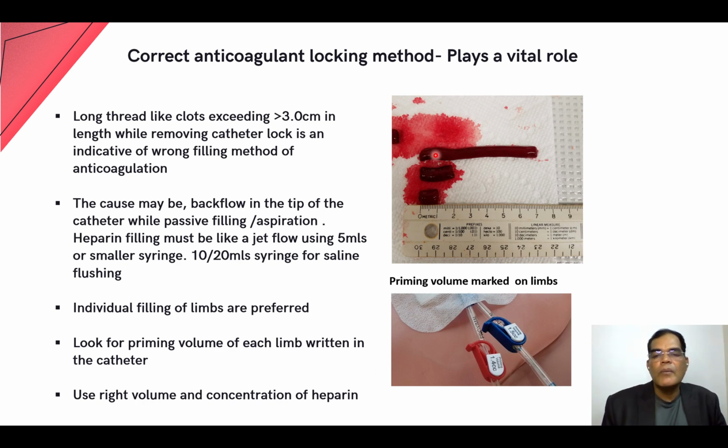The clot formation could be because of backflow through the catheter, and some people have a practice of aspirating a little after pushing, to see. That is a wrong practice. That means the tip of the catheter will still have blood, not heparin, and after two days this portion gets clotted and the patient's catheter might get clotted. So this carries a lot of risk. So the filling procedure is a jet flow and clamp simultaneously.